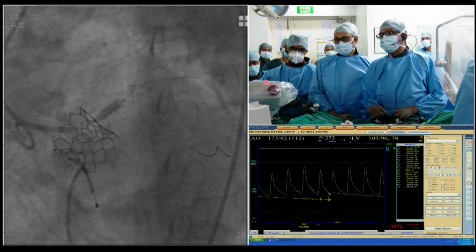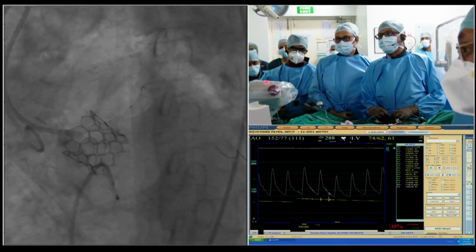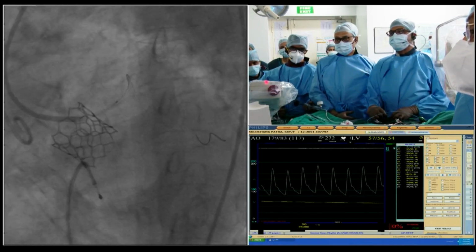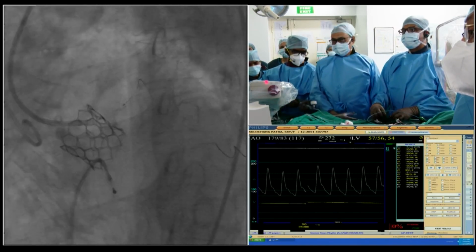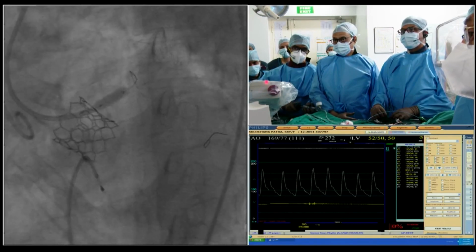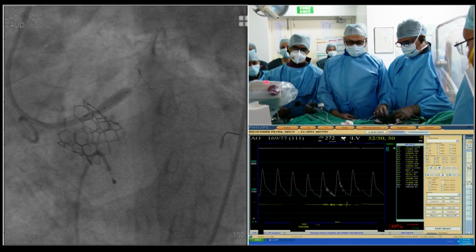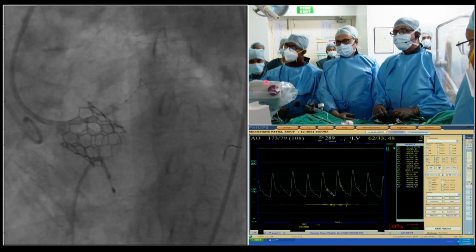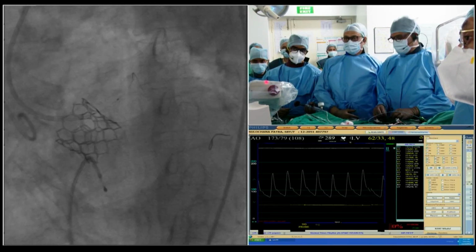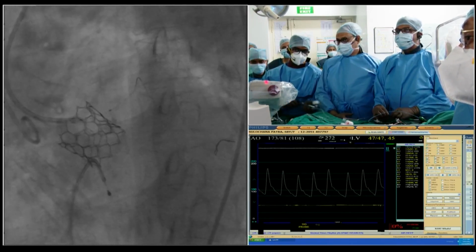What is the size of this stent? 4012 Zions, sir. So balloon again. Then maybe we use a 5 balloon to dilate. Inflate. Okay, down. I was just inflating with the same balloon a little bit to make sure that we are okay. Okay, I just want you to inflate one more time.